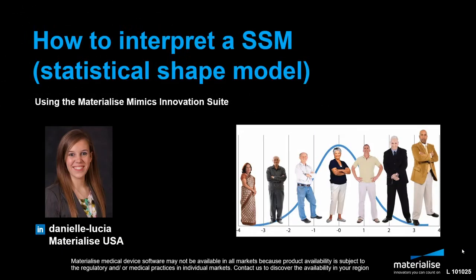Hi, I'm Danielle Lucia, and today I'd like to talk to you about how to interpret a statistical shape model in the Materialize Mimics Innovation Suite.